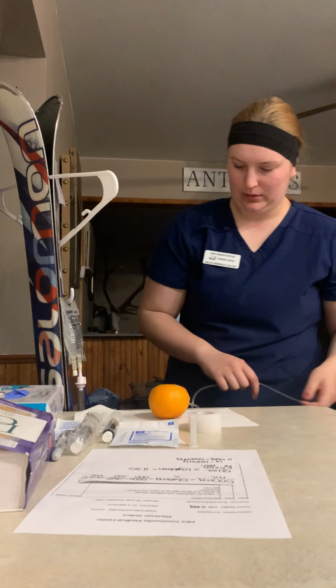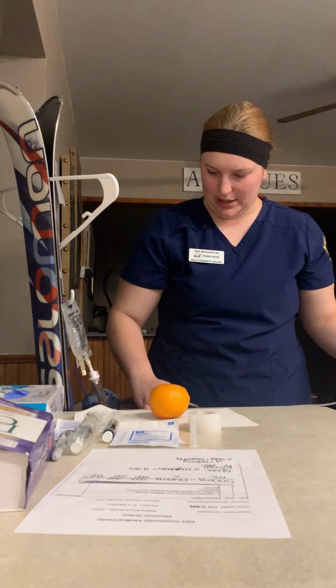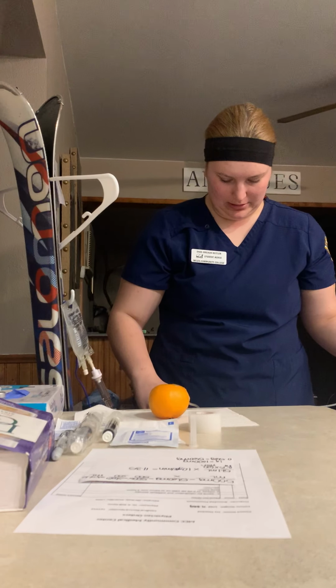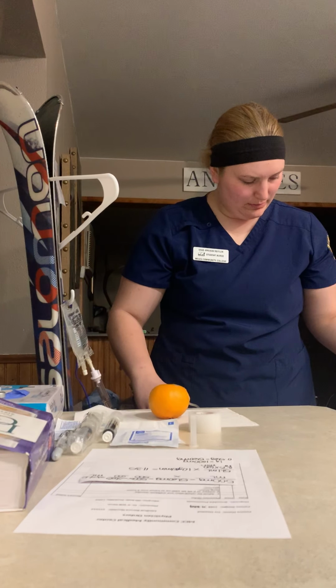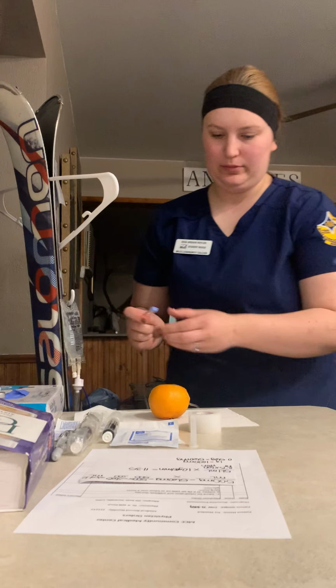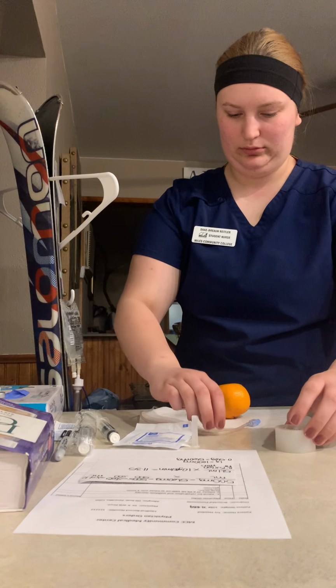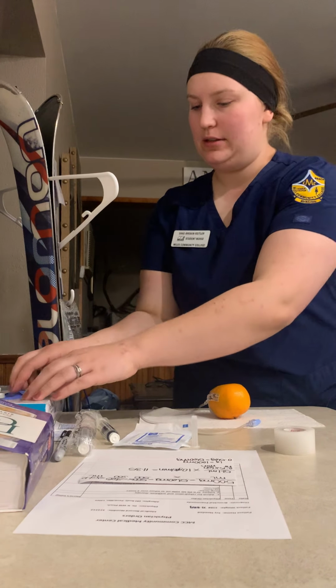Okay. I'm just gonna prime my tubing here. Get it all the way to the bottom. Okay, and I'm gonna wash my hands.